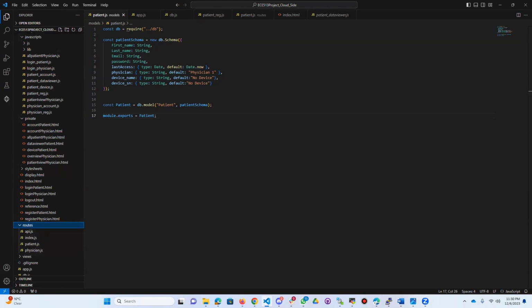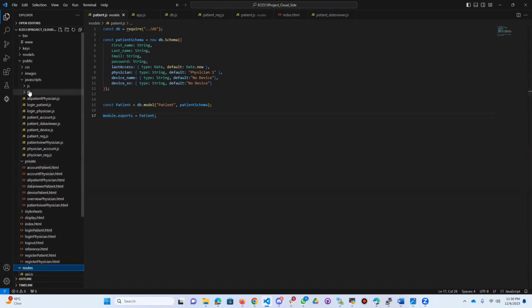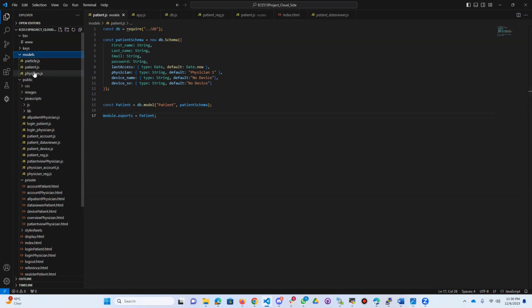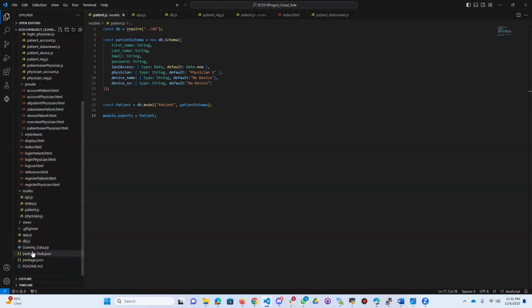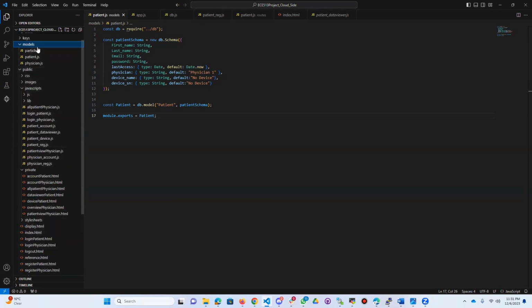And then the module, where's the module file? Here is the module file. You can see three database structure files. Here the data is stored in this format. And if we move to modules again, where is it? It was here, and patient.js, I guess it's here.